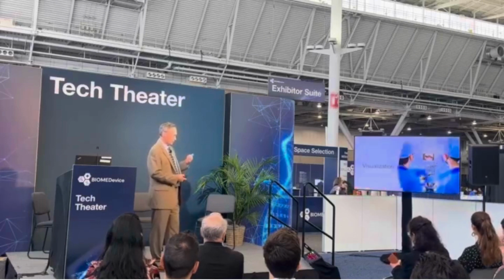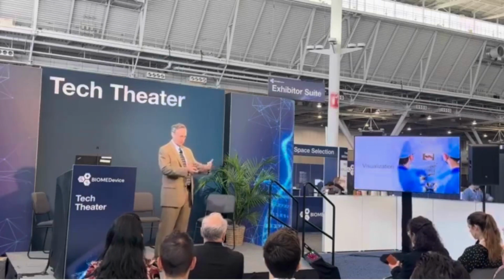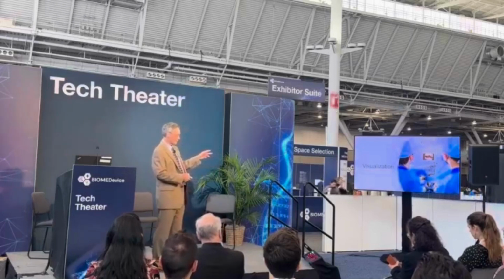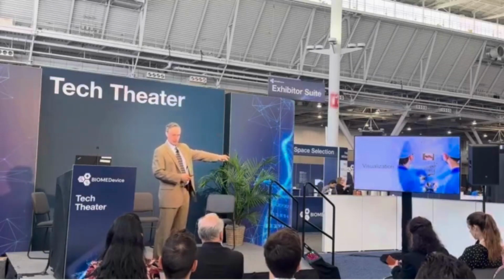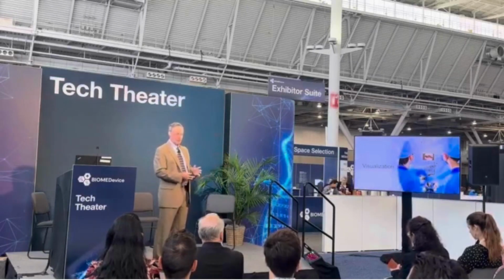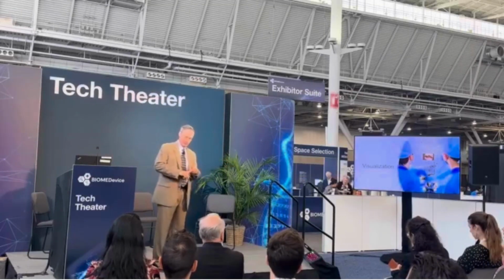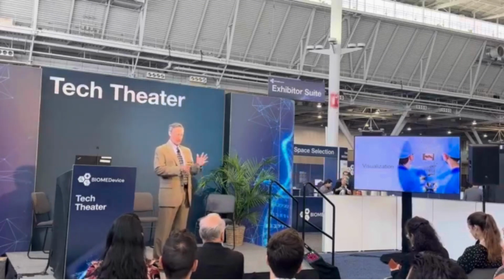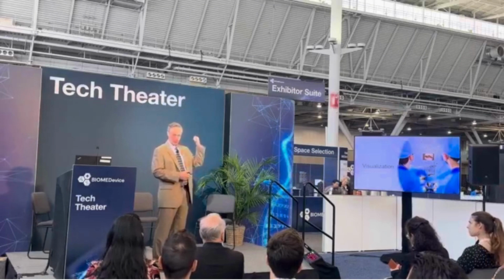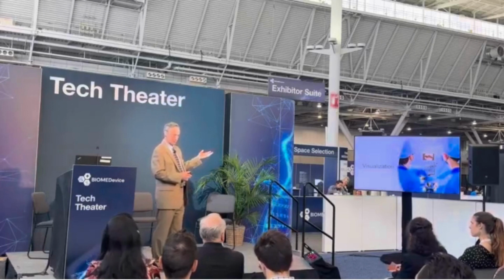Visualization. I pulled these images just off the internet, just on Google, and I thought this one looked interesting. It's interesting because while this setup looks really crisp and efficient, that monitor is quite a ways away from people that need to see what they're doing. Companies spend millions of dollars on image quality to be able to identify different tissues, to get the lighting right. These things are very expensive, and then they put the monitor like in a different zip code in the operating room, and they expect the surgeon to be able to do that.